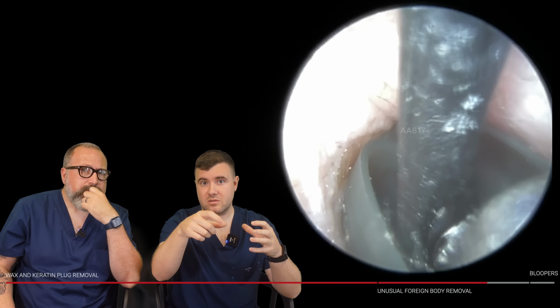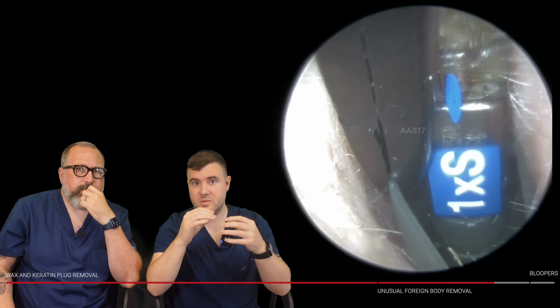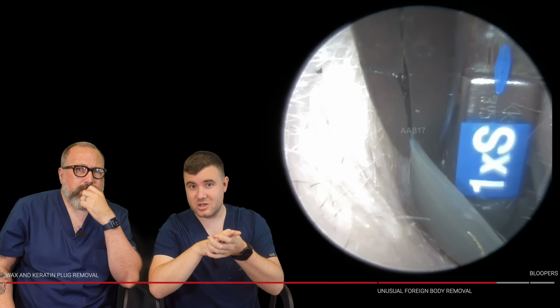Yeah, it's starting to move. You can see it starting to move here now. So as I move the Jobson horn away, you can see that's now repositioned. So the dome's in a slightly different place. We can see the receiver's now not anchoring this so much into position. I did explain to the patient there's maybe a little bit of pressure here, but you can see that, there we go. Wow. Popped out. That was wedged in there, wasn't it?